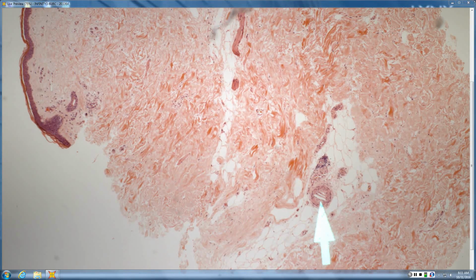And if you've got someone with blue toes on the ward and you really want to find them, you go right in the middle of the blue infarct and you ask them to do frozen section. Because here, this is formalin-fixed paraffin-embedded, routinely processed, all the cholesterol's gone. But if you do frozen section and polarized microscopy, it just lights up like a diamond down in that vessel. It's just a thing of beauty.